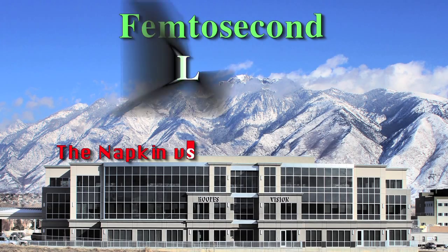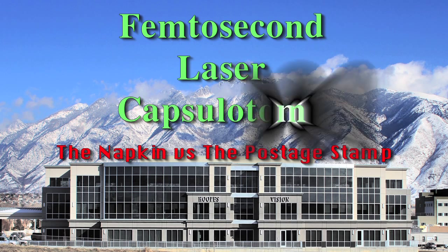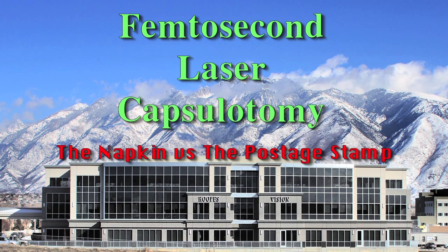Welcome to our ASCRS film entitled Femto-Laser Capsulotomy, the Napkin vs. the Postage Stamp.